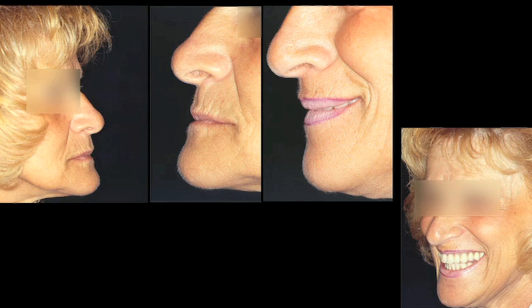Her lower third now has not really changed much. We've done all of the adjustments in the maxillary third, but with that increase of vertical dimension, notice her chin point. Because going back, when you open someone's vertical dimension, on the arc of closure it will allow for the mandible to swing posterior. So as you increase her vertical dimension, the mandible will drop down, and on the arc of closure, it will bring the chin back automatically. And that's what's created our patient to give her a smile.